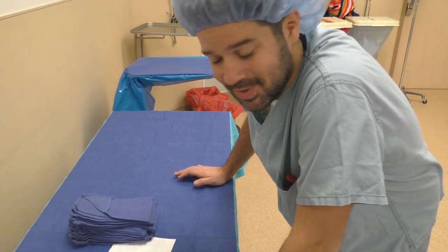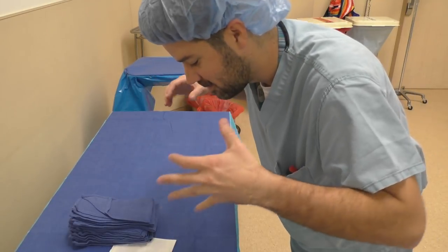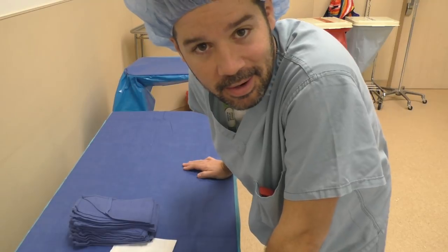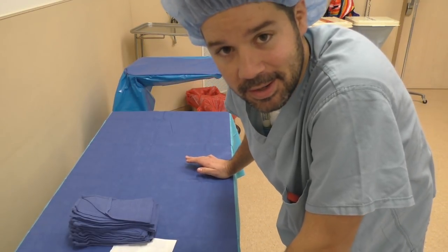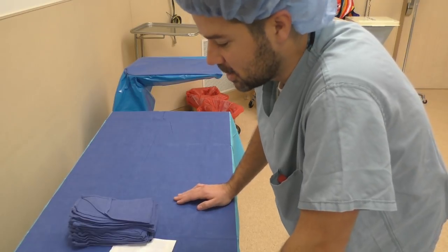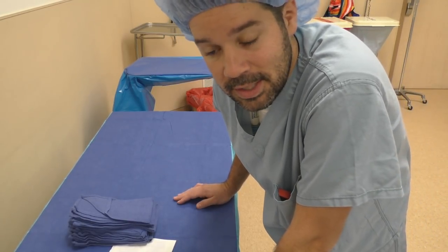I just want to preface this: this is not a sterile setup. Obviously I don't have any gloves on, I'm not sterile, I'm not wearing a gown or anything like that. I'm touching this back table with my bare hands throughout the whole video. This video is just to show you the techniques that you will need to learn.